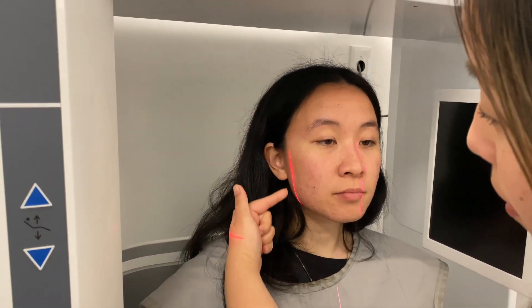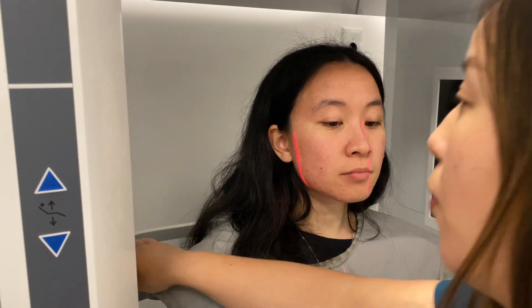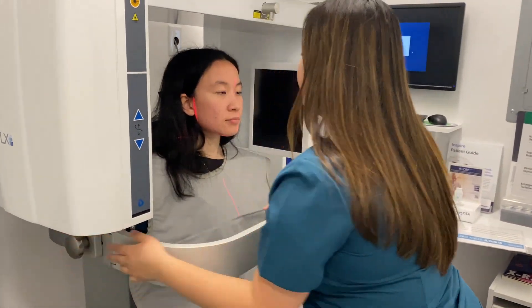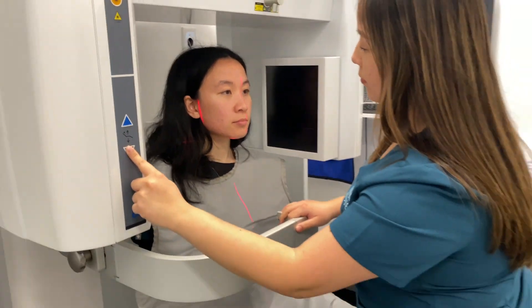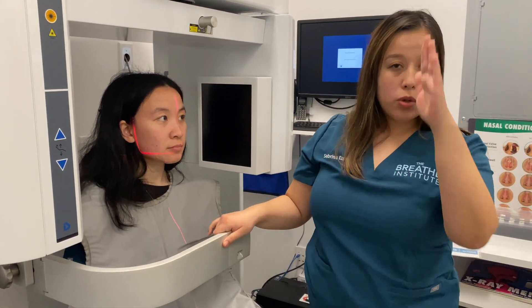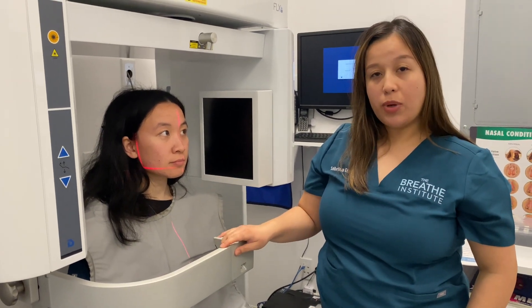The first thing we're going to want to do is make sure that this vertical line is right before Sam's ear. What we're going to want to do is bring her forward, and then we're going to want to bring her down or up a bit depending on where the line stands, so that the horizontal line can be right below her lip. It is ideal that patients are also midline during the CT scan. So what I will ask Sam now is for consent so that we can move her head.